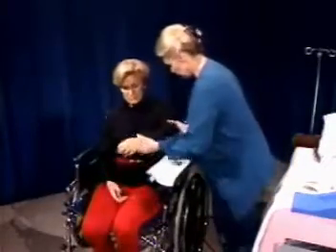Control over that arm or active movement. And then the arm can be positioned such. However, in many stroke patients, they run the potential of having a lot of swelling in their arm, and to have it in this flat manner may help their trunk control, will be a good position for their arm, but it does not help with swelling.